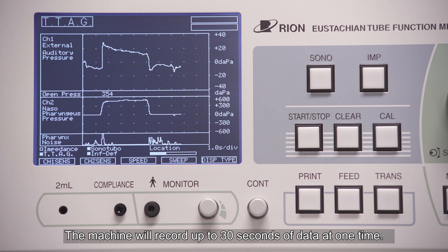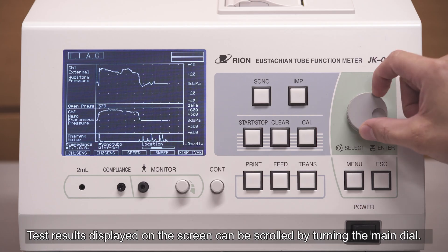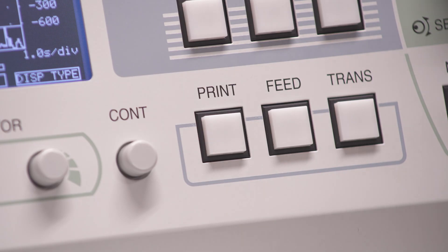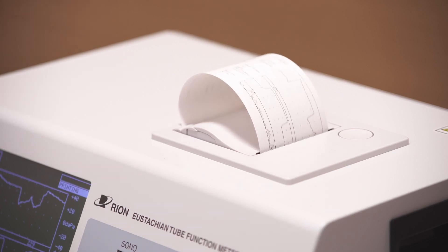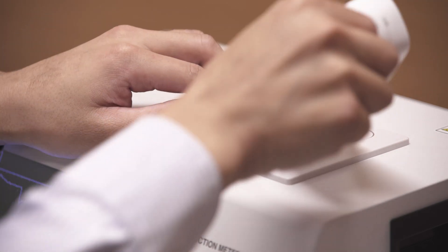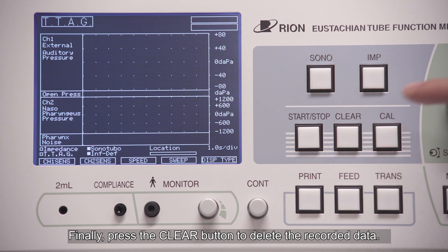The machine will record up to 30 seconds of data at one time. Test results displayed on the screen can be scrolled by turning the main dial. Push the print button to print the test results. Finally, press the clear button to delete the recorded data.